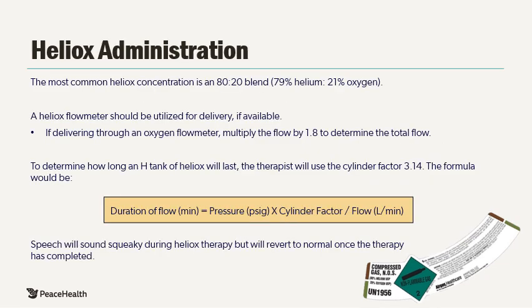At Peace Health, we use the most common Heliox concentration of 80-20 blend. These tanks are actually filled with 79% helium and 21% oxygen. You can also find a 70-30 blend.